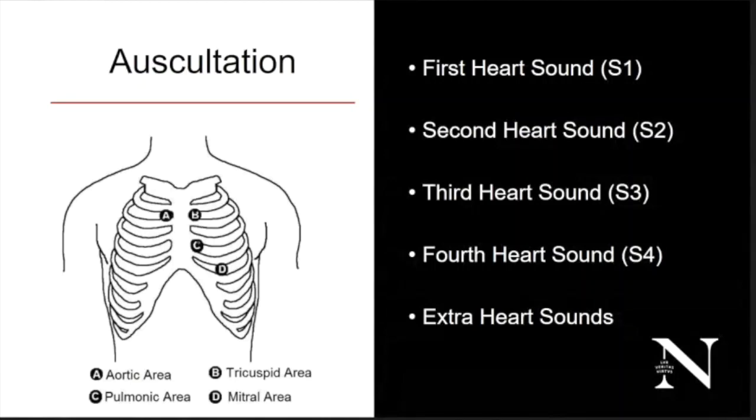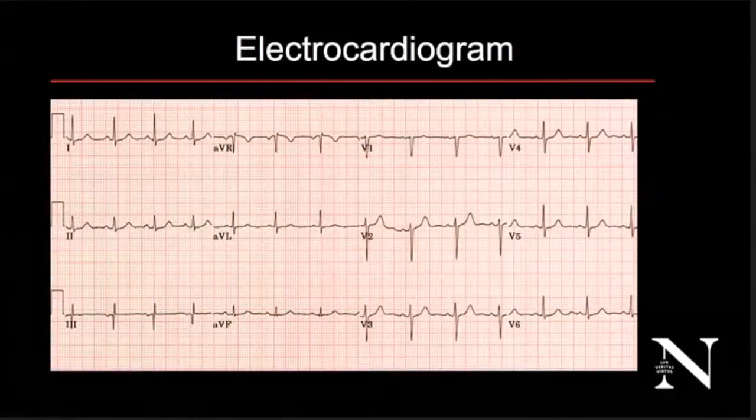We are going to continue to listen to the heart, but I'd rather look at it. The EKG will forever be an important part of what we do when we examine the heart, right? There's no better way to follow the conduction of the heart than to watch a P wave, an atrial depolarization, a period of time while it gets through the AV node, a QRS as the ventricle depolarizes, and then the T wave as it repolarizes.